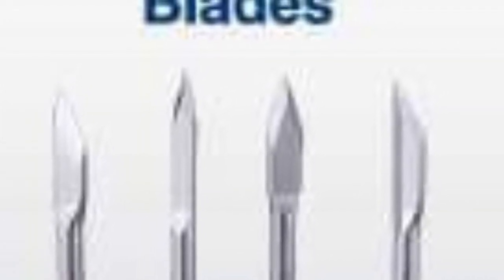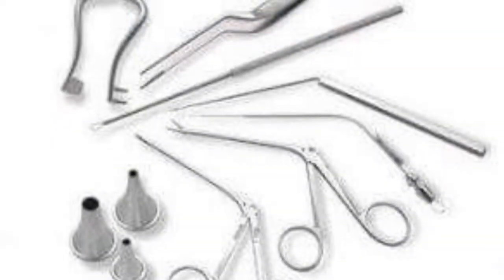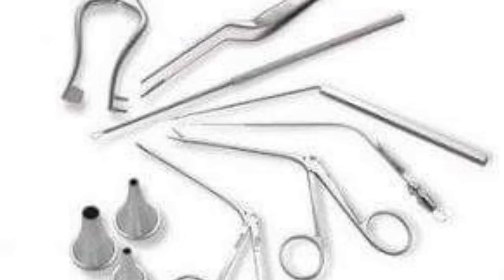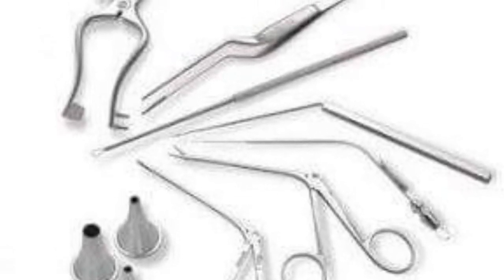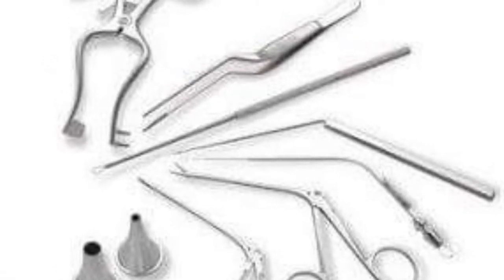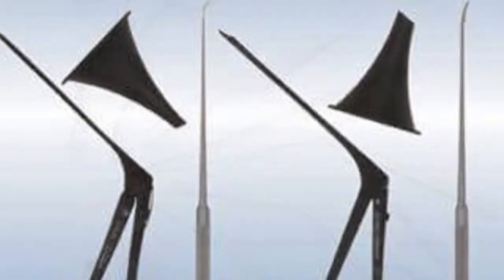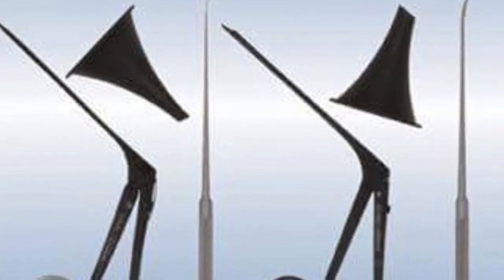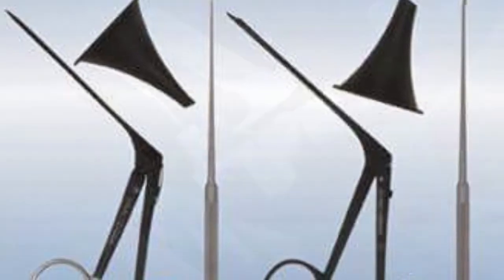Supplies include a small basin, warm saline, bulb syringe, suction tubing, myringotomy knife, myringotomy tubes, cotton balls, and microscope. Equipment includes padded foam or gel headrest, padded upper extremity restraints, suction, fiber optic otoscope or microscope, and sitting stools. Instrumentation includes a myringotomy tray and hand grips for the microscope.